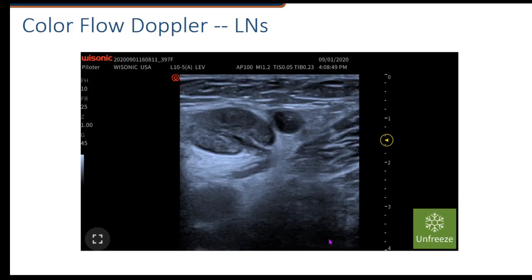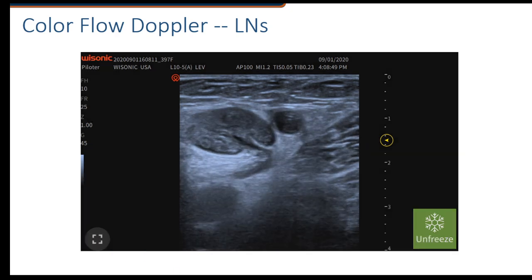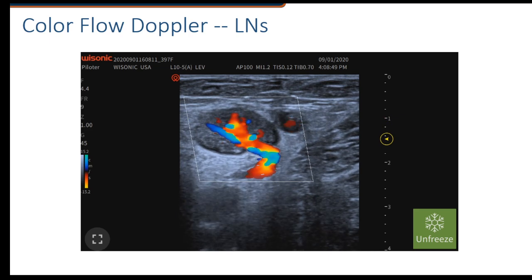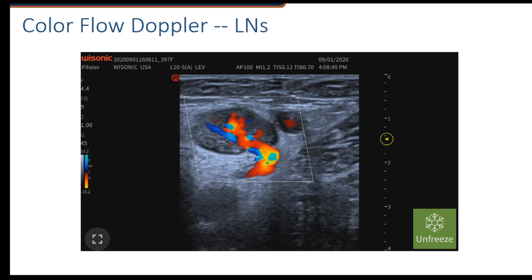This is actually a really large lymph node, however it has not lost its ratio. This image is compliments of Dr. Torino, and this is actually an inguinal lymph node. Look how kidney-shaped it looks — remember when you look at a transverse kidney and can actually see the vasculature in and out. She was able to get a really impressive vascular flow pattern on this. You can try putting a real low flow pattern onto the lymph nodes in the neck, but they tend not to show up really well. If you happen to see a larger lymph node, you'll be able to see that hilum and that vasculature going in.